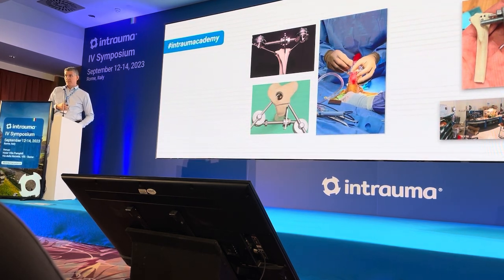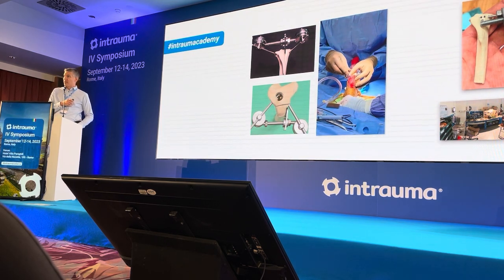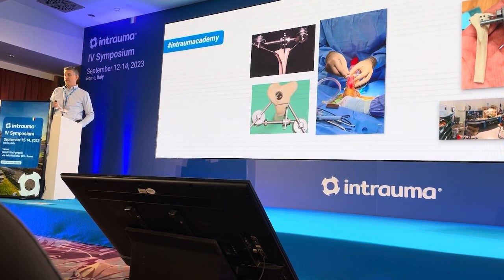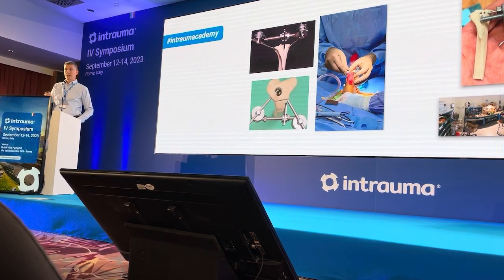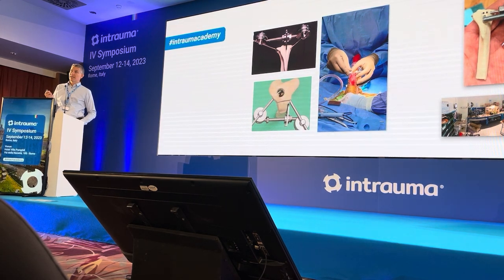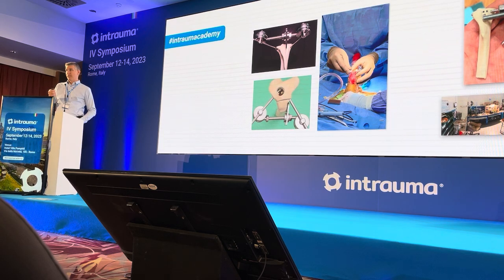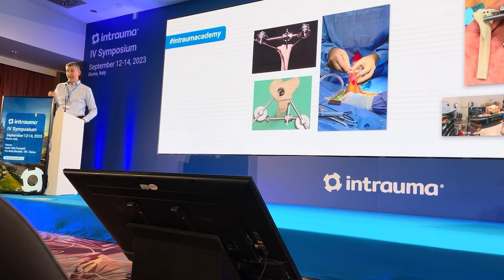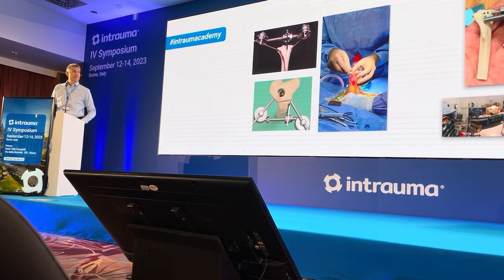This video is here, and we're going to return to this point several times to point out that this technique is based on slow bone bending of viscoelastic bone. And so, many times I hear people say, no, I've used this technique, however, I don't use the jig, and I use a pin or an osteotome or some instrument to simply move the tuberosity and translate it. I would argue that you're not doing this technique correctly, that if there is a robust distal tibial crest, as should be planned, it is not possible to do this at the correct speed without the tool.